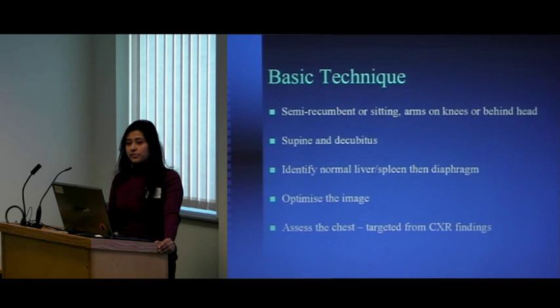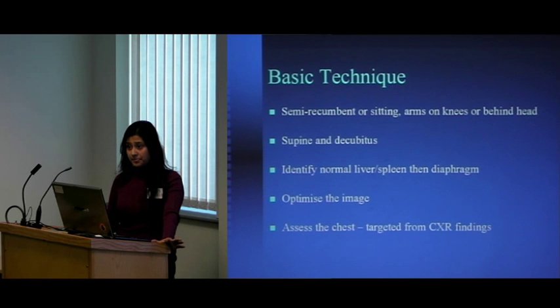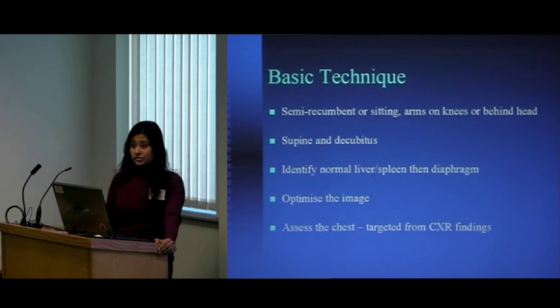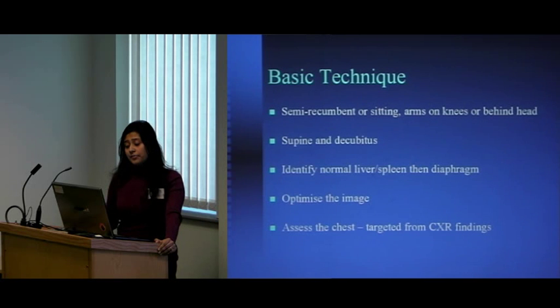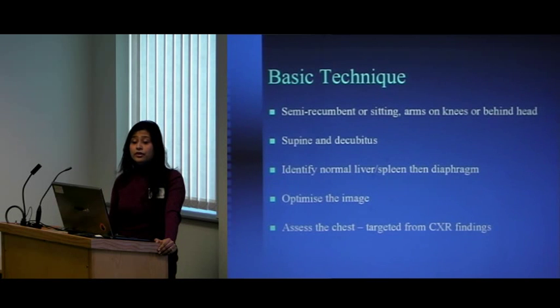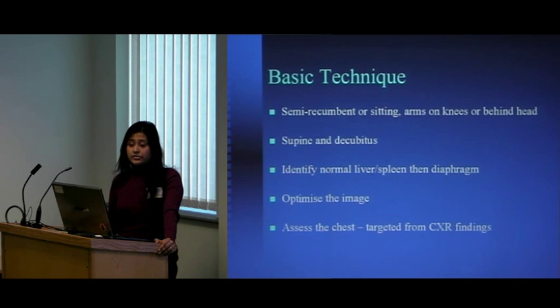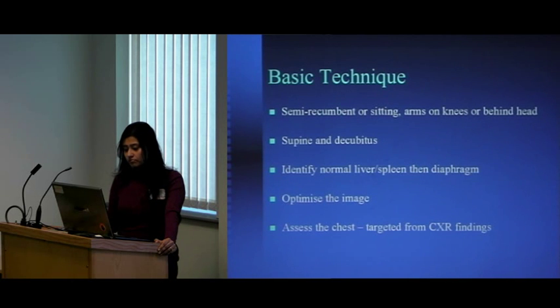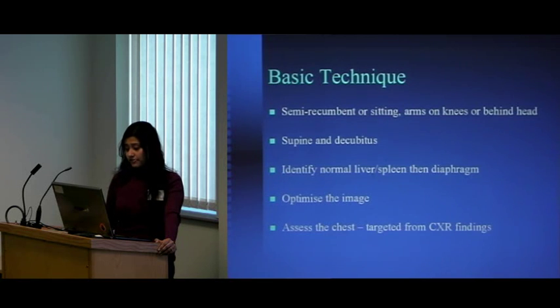Optimize your image — three buttons are important: focus, gain, and depth. The depth button allows you to increase depth to see deeper structures or reduce it to see superficial structures like the chest wall and pleura. Bring the focus down to the area of interest for the best image. The gain button allows you to adjust image contrast. Once you've done all that, remember the chest X-ray findings and target the chest using those X-ray findings.